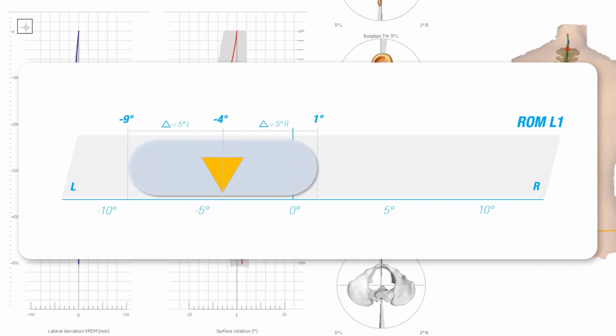At this moment, we know that bilateral segmental mobility is given. Asymmetrical constellations are compensated for as far as possible. The orientation of the eyes to the direction of walking can usually be ensured under additional energetic strain. An asymmetrical rotation compared to an equally asymmetrical starting point would therefore be a much more noticeable deviation.